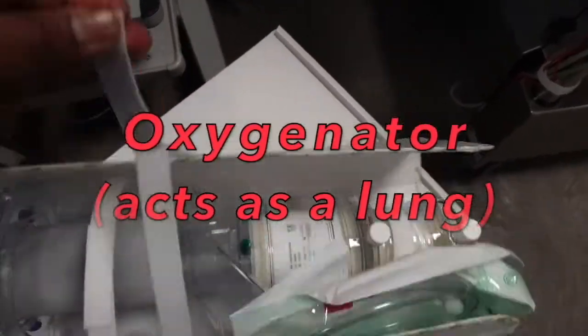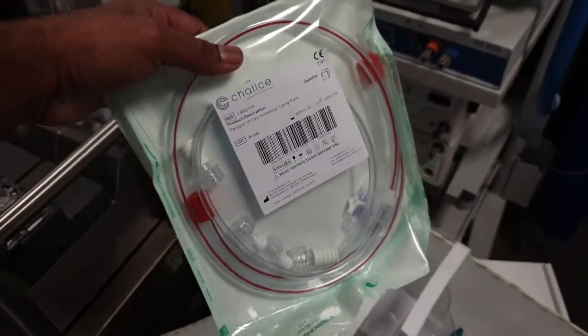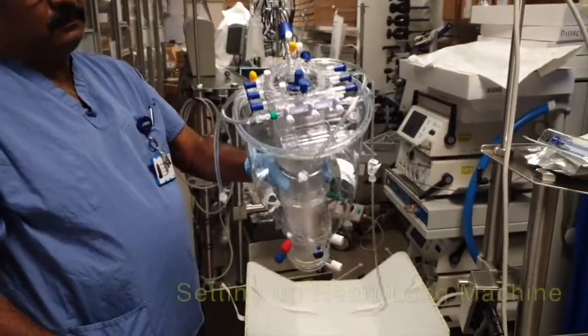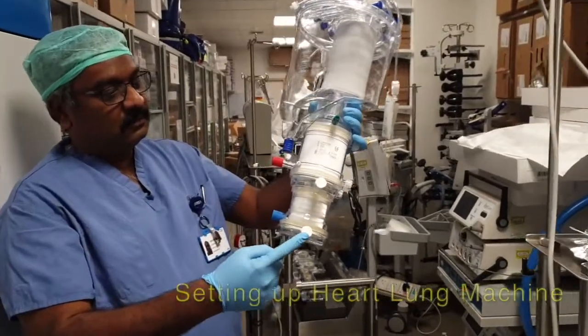We're getting ready the heart-lung machine for open-heart surgery. This machine takes care of the heart and lungs during cardiac surgery. This is called the oxygenator, and it works as an artificial lung.